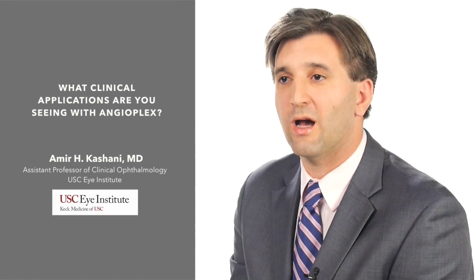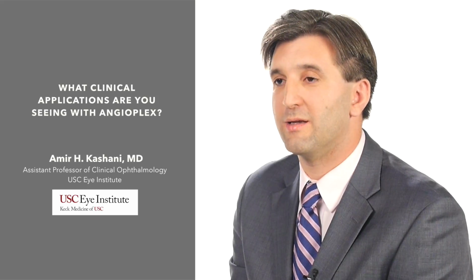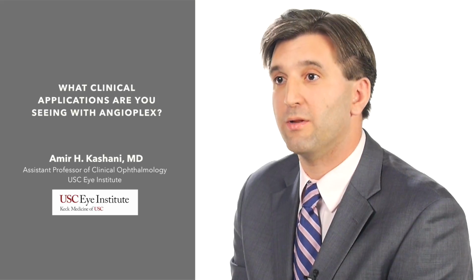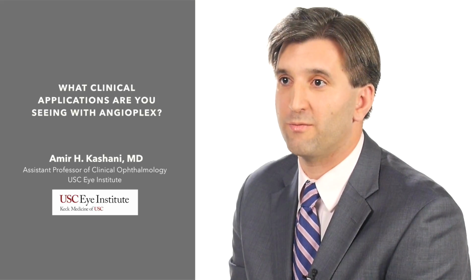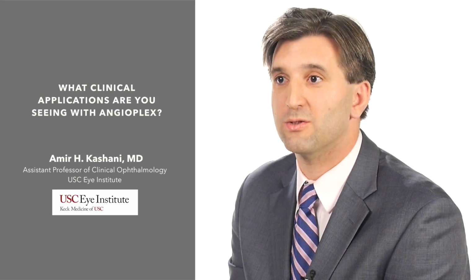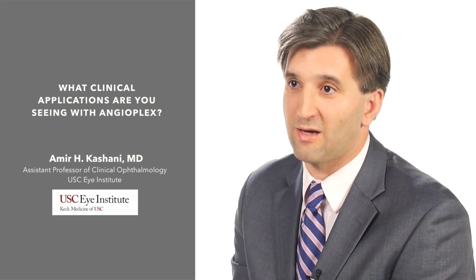So I think that there's a lot of potential applications, and one really obvious one is, for example, diabetic retinopathy. Diabetic retinopathy is characterized by changes in the vasculature that cause what we call capillary dropout or impaired capillary perfusion. And that's exactly what OCT angiography, or Angioplex, is going to allow us to look at now, because we can see exactly where there is blood flow and where there is not blood flow.